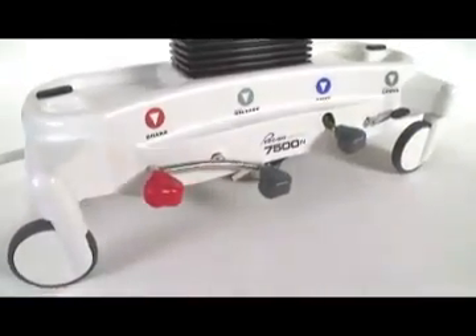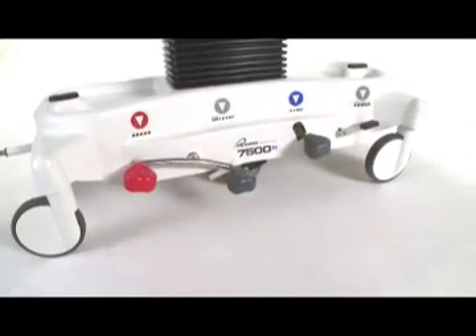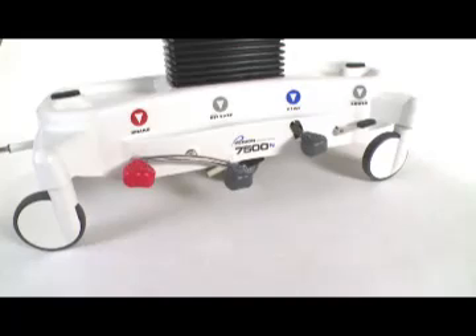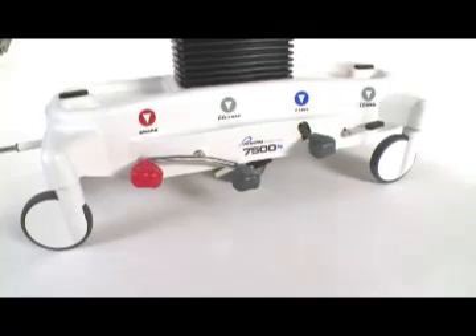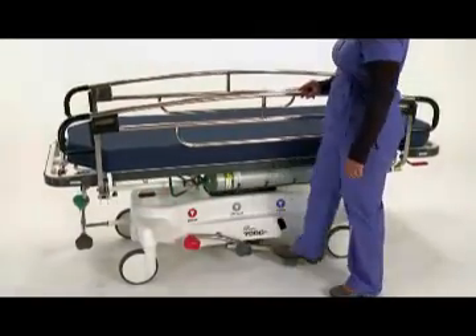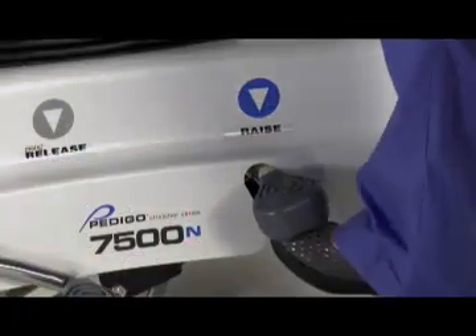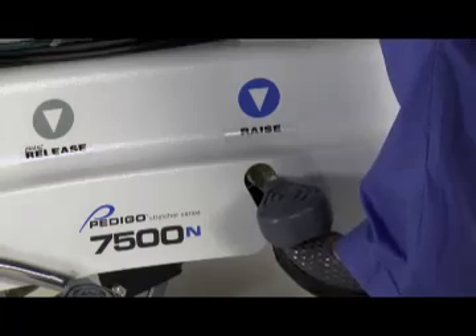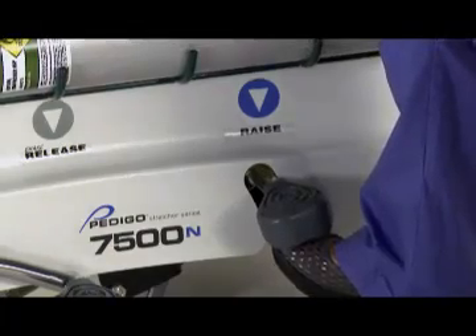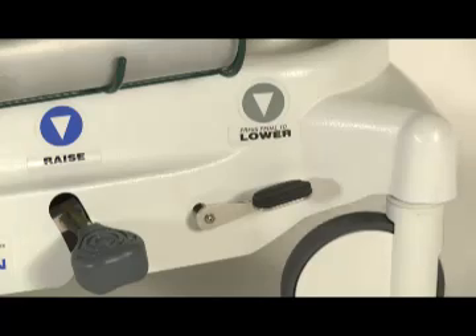Applying the brakes acts as a double lock. When engaged, the red pedal brake locks the 8 inch casters and keeps the wheel from rolling and swiveling. To disengage the brakes, simply depress the gray release pedal. To raise the litter top, depress or pump the hydraulic raise/lower pedal to the desired height. To lower the litter top, lift the underside of the pedal and the litter top will begin to descend. As an option, this 2-in-1 raise/lower pedal may be configured and factory installed as two separate pedals.